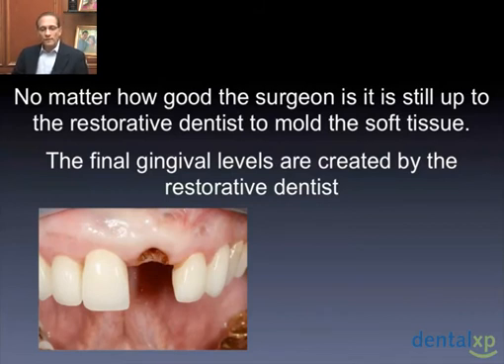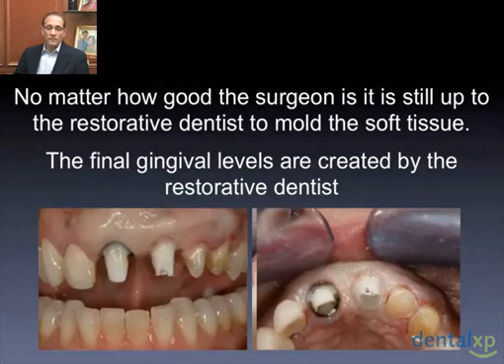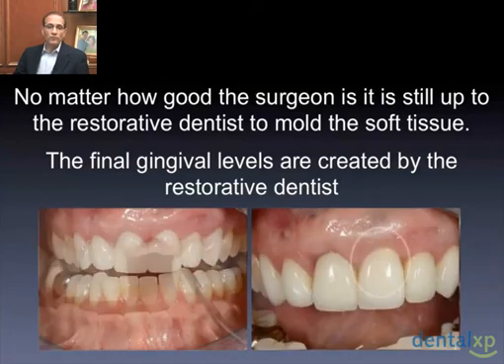So without doing this, there would be no way for us to have a predictable end result. We can create the provisional abutment, allow the tissues to be guided to the positions we want. We can create the restorative margin where we need it, and then communicate these findings to the laboratory. So in the end result, we end up with a very nice soft tissue emergence and a beautiful restoration that blends into the natural dentition in a way that can't be distinguished from an implant or a natural tooth.